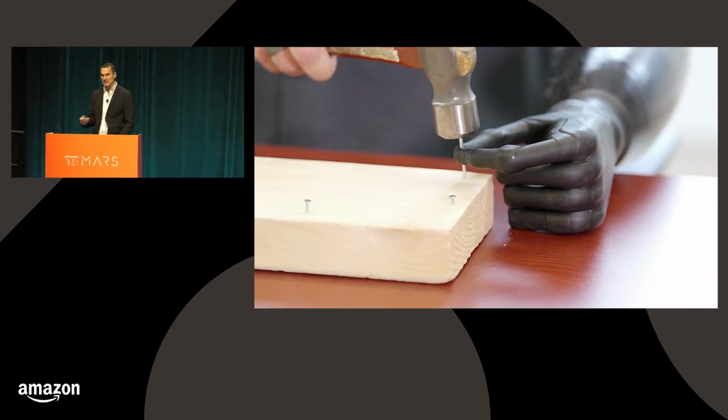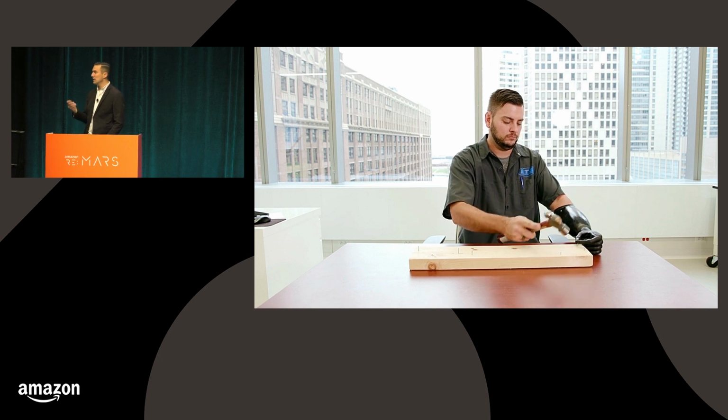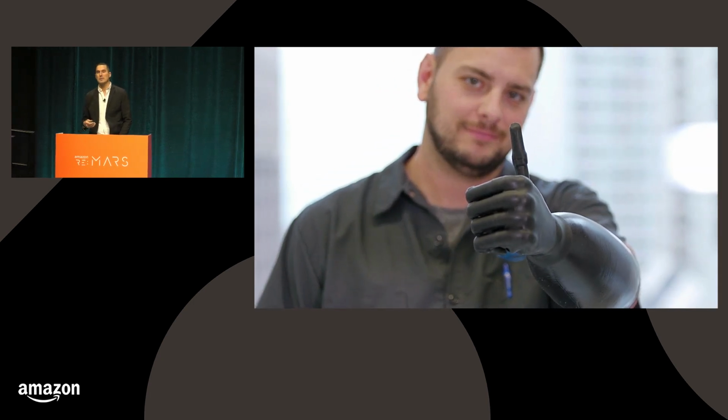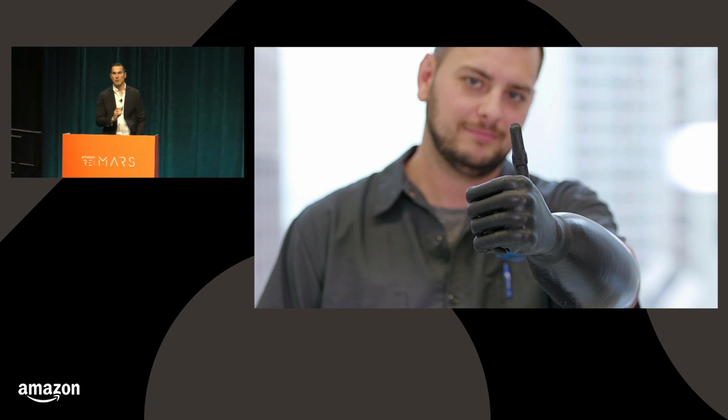If an upper limb prosthesis makes a mistake, he'll drop his tool, or drop his phone. But if a lower limb prosthesis makes a mistake, someone could fall down a set of stairs. So this near perfect target required for the control of lower limb prosthetics has prevented their translation out of the lab.